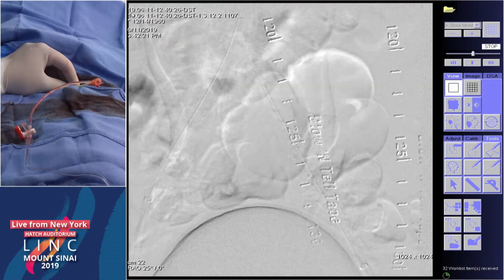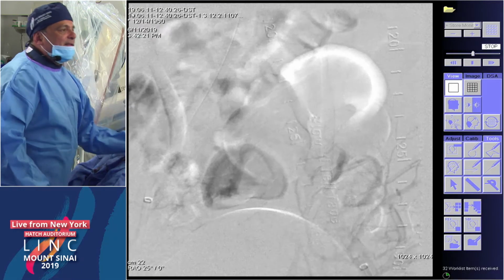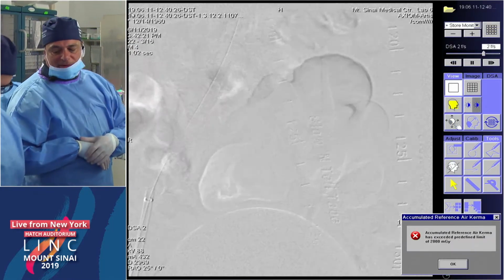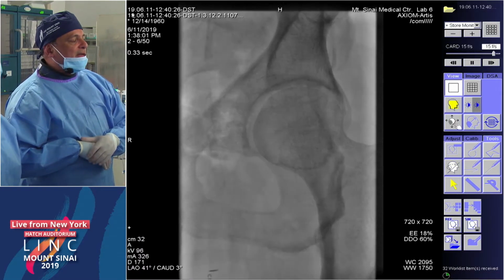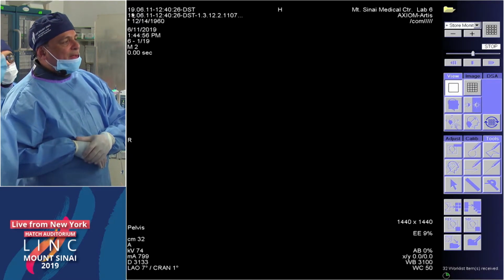Inject. So it's above the hypogastric, Jim. But if you go back plus to the aortogram, guys, so Dr. McKenzie can see while we treat this, plus, and Dr. Scheinert, and you can see here that the hypogastric is spared.